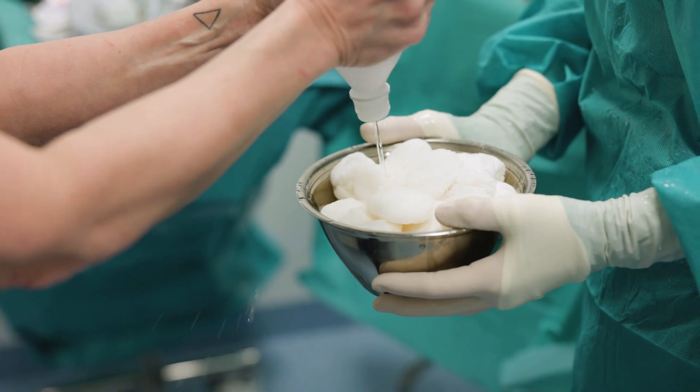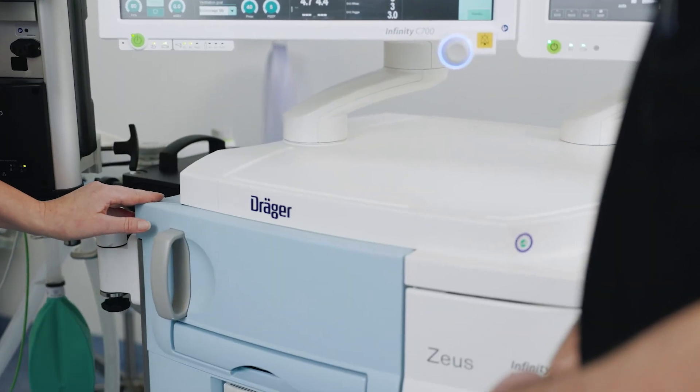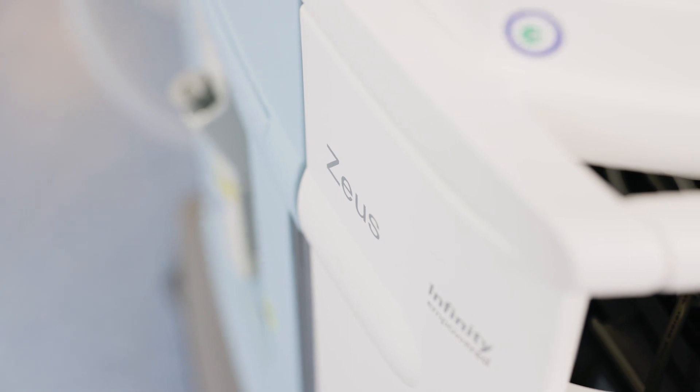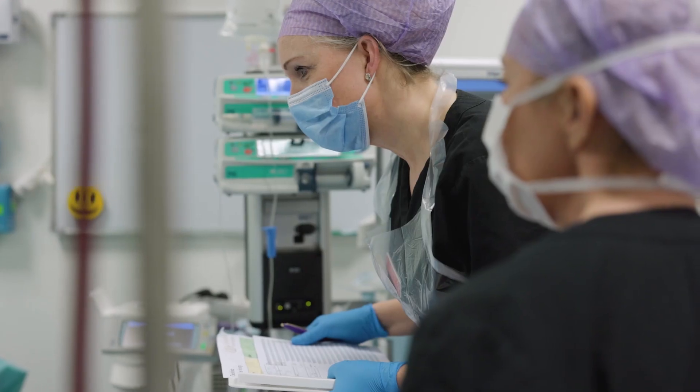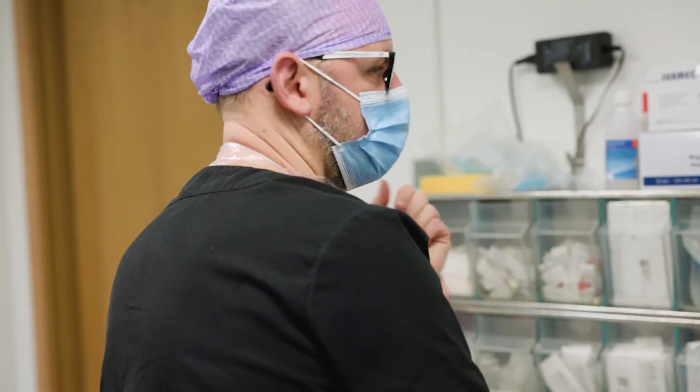To achieve an adequate depth of anaesthesia we work with target anaesthesia. Based on what we know about the patient's previous anaesthesia and the patient's height and weight, we set targets, and there we get good help from SmartPilot View. We use significantly less vasoactive drugs to maintain our patient's blood pressure since we started with target-controlled anaesthesia and SmartPilot View.